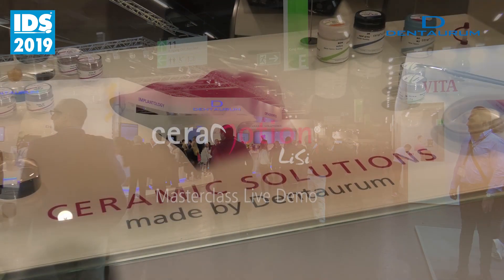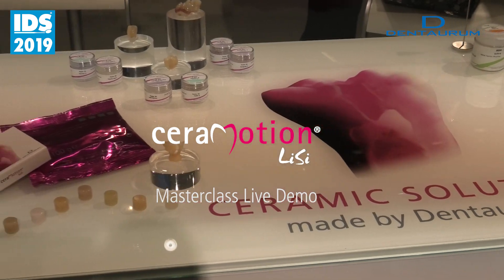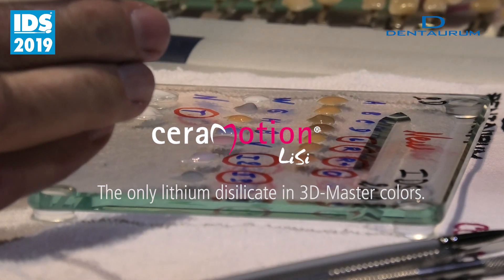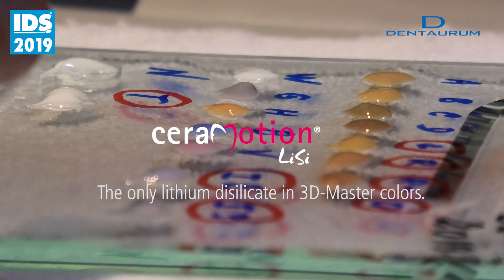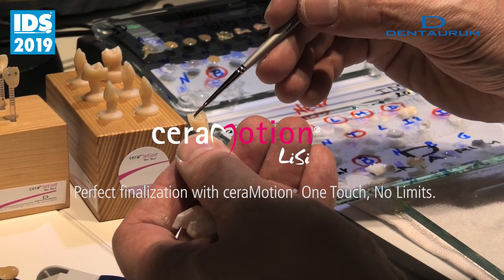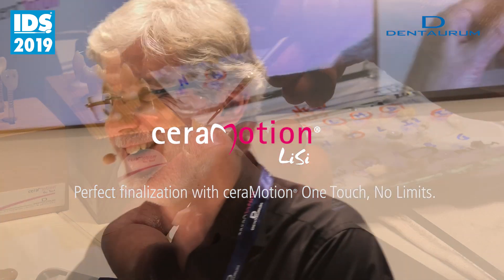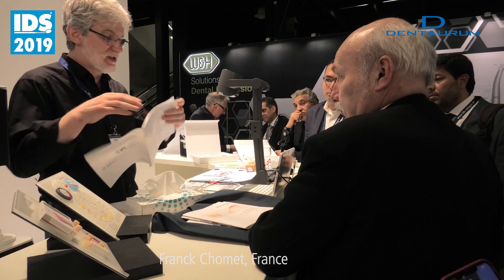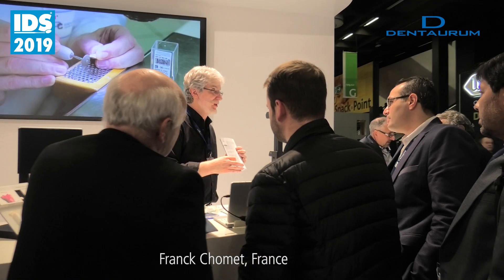Thank you for joining us. In the employment mode, you have the list of products — maybe it's not comfortable in English, it's delicate for you. Here you have the Vita Classic Sheds and here you have the 3D Master Sheds. We propose to you the most popular sheds.